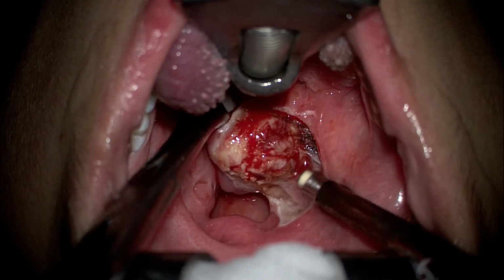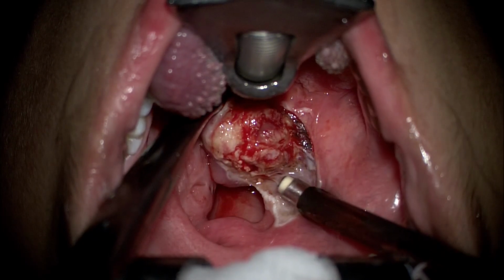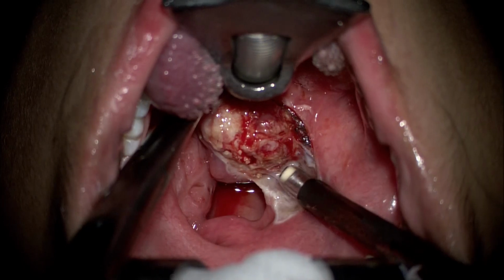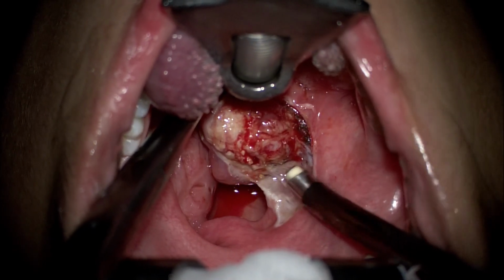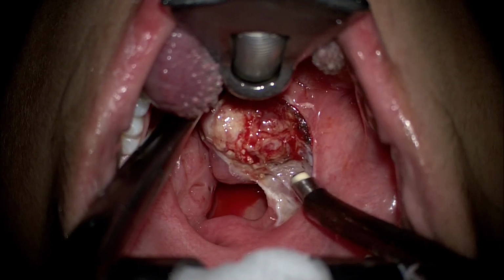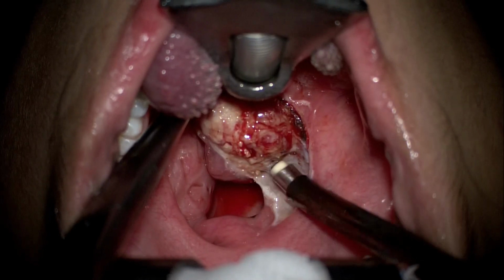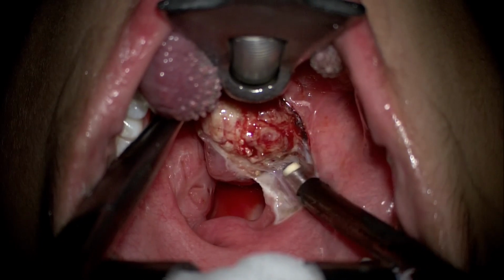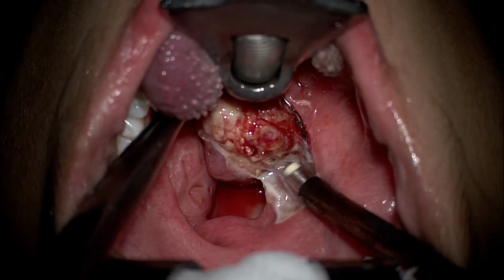As you can see there, we are right on the surface of the tonsil, the lymphoid tissue. Sometimes if the patient has had recent episodes of tonsillitis, this plane can have some extra vascularity, and if that be so, this surface, which is going to be removed anyway, can also be safely coagulated without any worries or any addition of pain, because most of this oozing is happening from the portion of the tonsil that is going to be excised anyway.